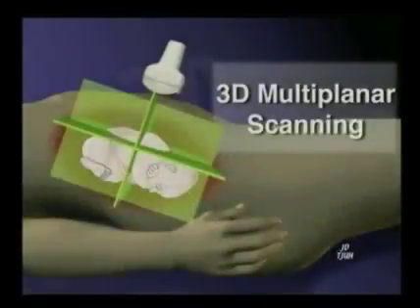So here is a diagram just to go over the capabilities of volume imaging to obtain image planes that are impossible with 2D ultrasound. So here we have a 2D ultrasound probe that is trying to acquire the fetal spine, let's say. My options typically with 2D ultrasound would be only two. I would either get a SAG or I'd get a transverse. If I would have a need to obtain a coronal plane, that is simply impossible.